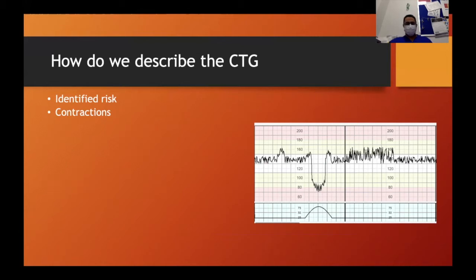Anyone online? What does the word baseline mean? It's the average. No. Average is average, or mean, or median. But what does the word baseline mean?